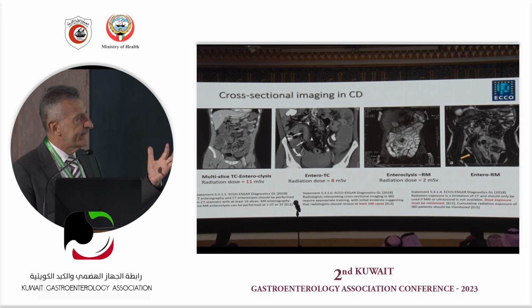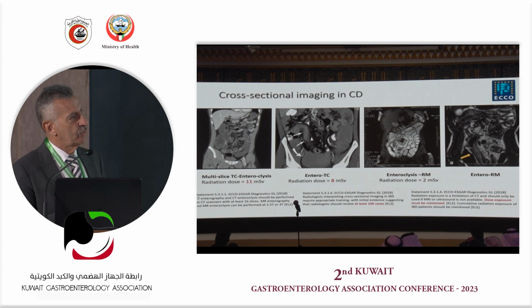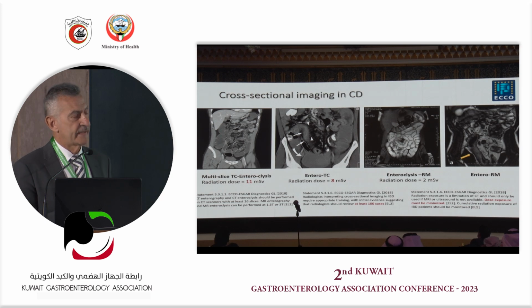You have a very fancy multi-slice CT enteroclysis. You see all the details there, but you have 11 millisievert of radiation exposure. If you go to entero-CT, you reduce it quite a lot. If you go to enteroclysis, great definition even there, but you need some radiation exposure to position your catheter. And probably in most cases, entero-MR is quite enough, no radiation, very good efficacy.